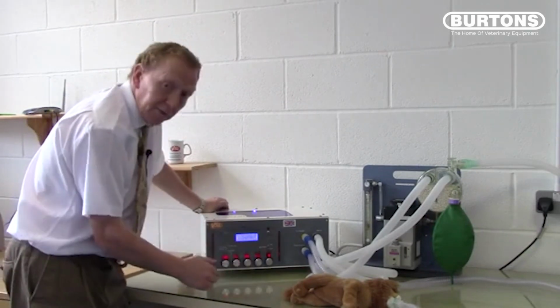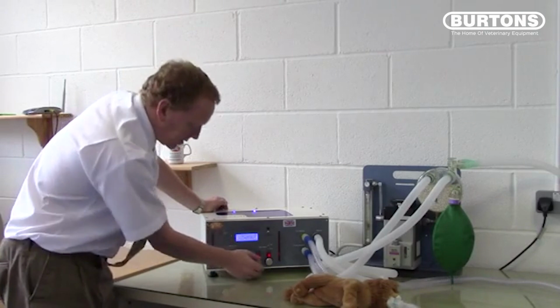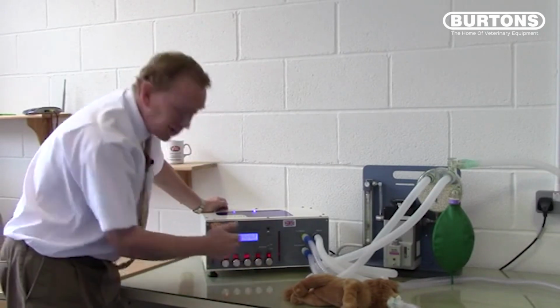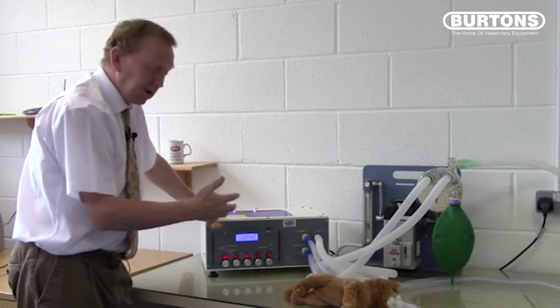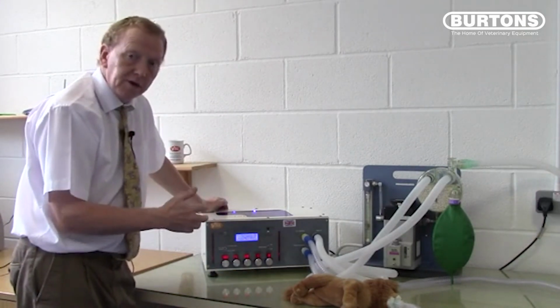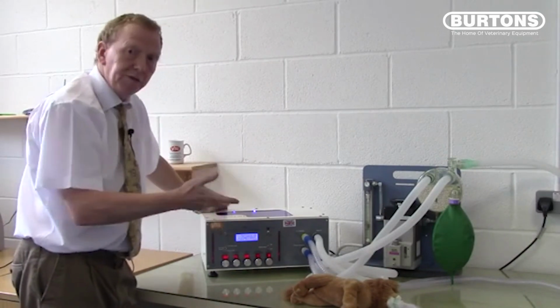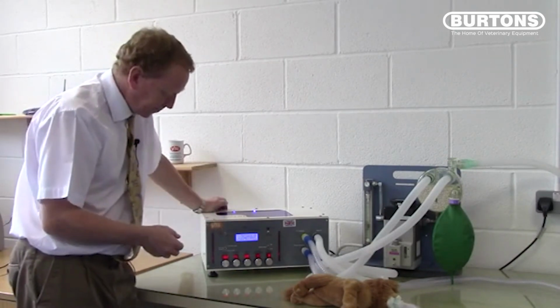But this time our maximum airway pressure has become our target, and so we set this to 12. So this is our target airway pressure, and if we've made our calculations correct, then we should find that the volume delivered will be about 150 mils, as we had with the previous volume cycling.